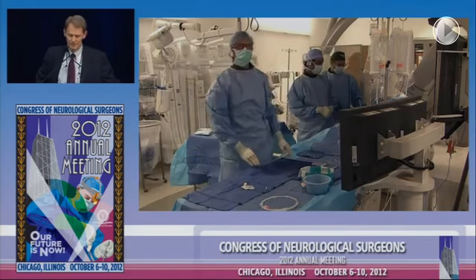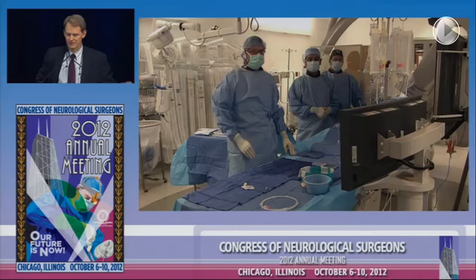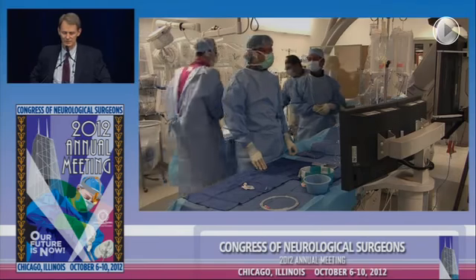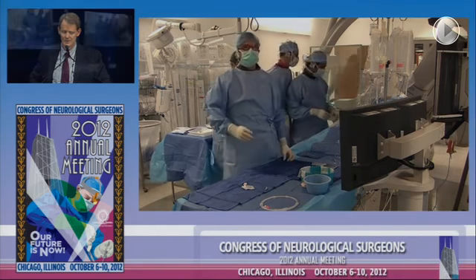So given the fact that that one went so smoothly, we do have another patient that is ready to go. And Adnan and Ken and Travis, do you want to tell us about this patient? Yes. Yeah, show the slides, please.